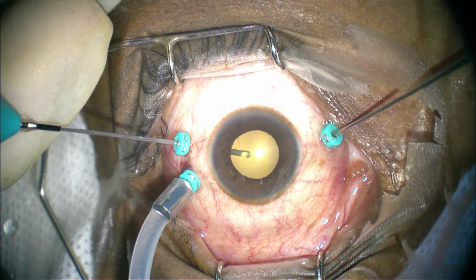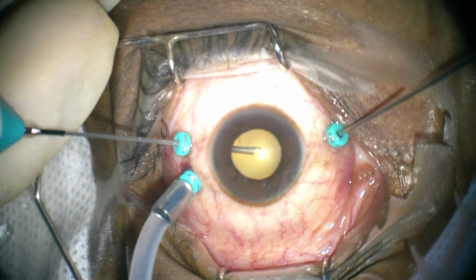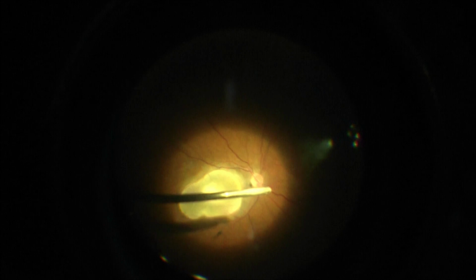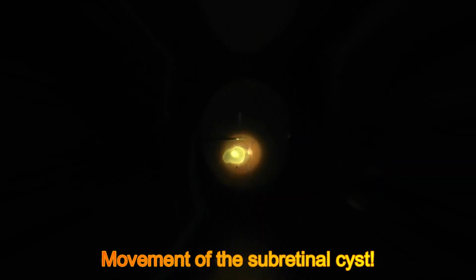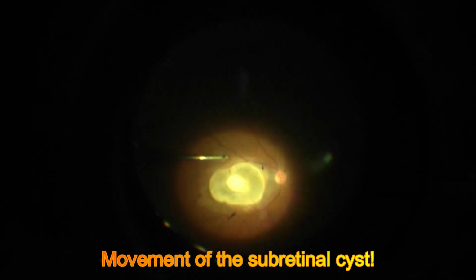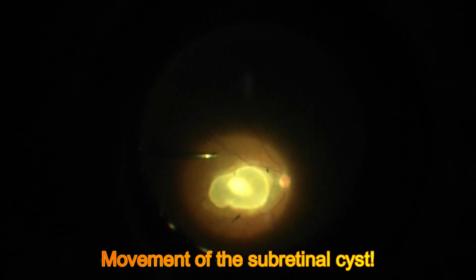25 gauge pars plana vitrectomy was performed. Anterior, port site and core vitrectomy was done. During core vitrectomy, something peculiar was noticed. It was a live subretinal cyst as suggested by its movements.